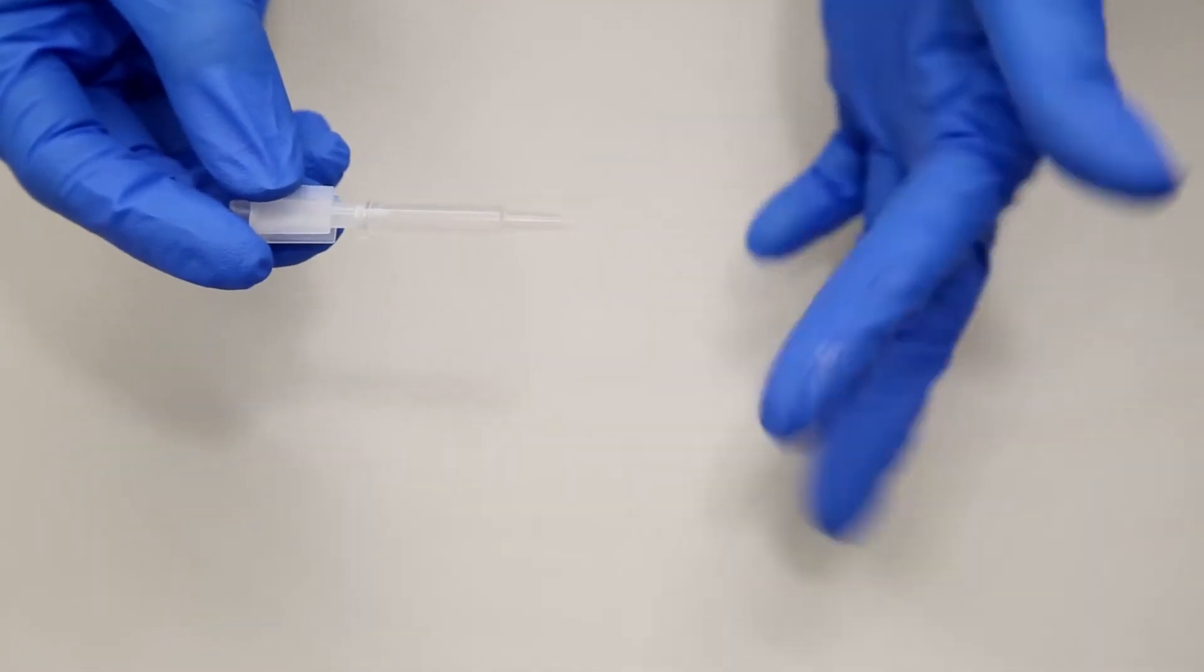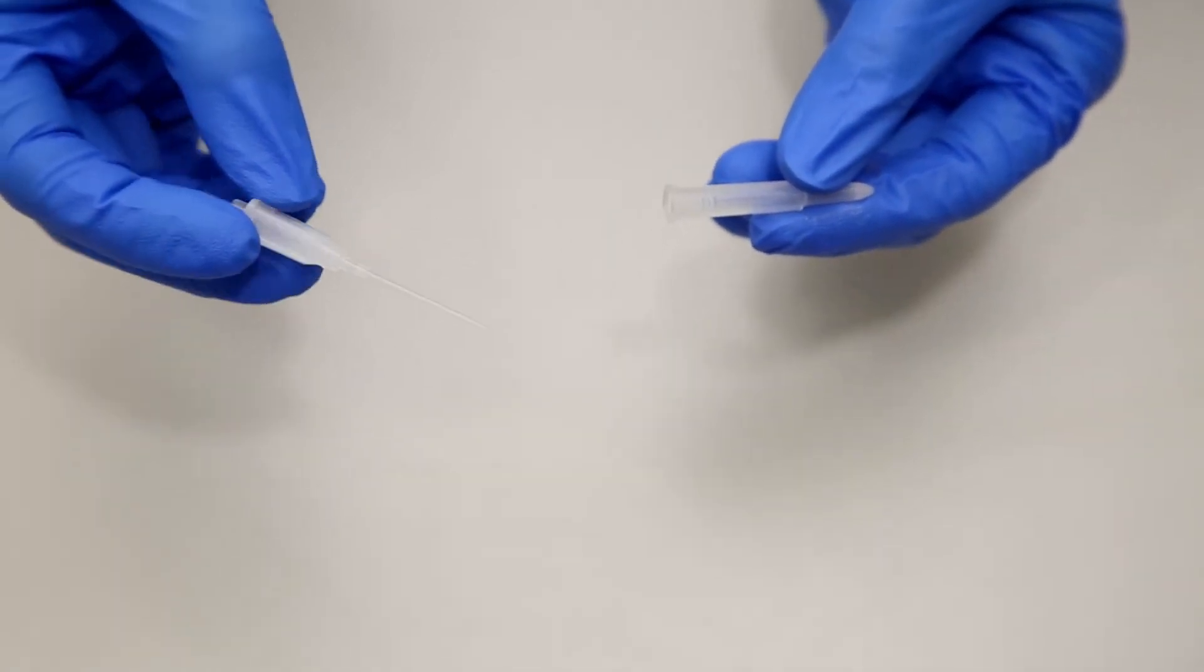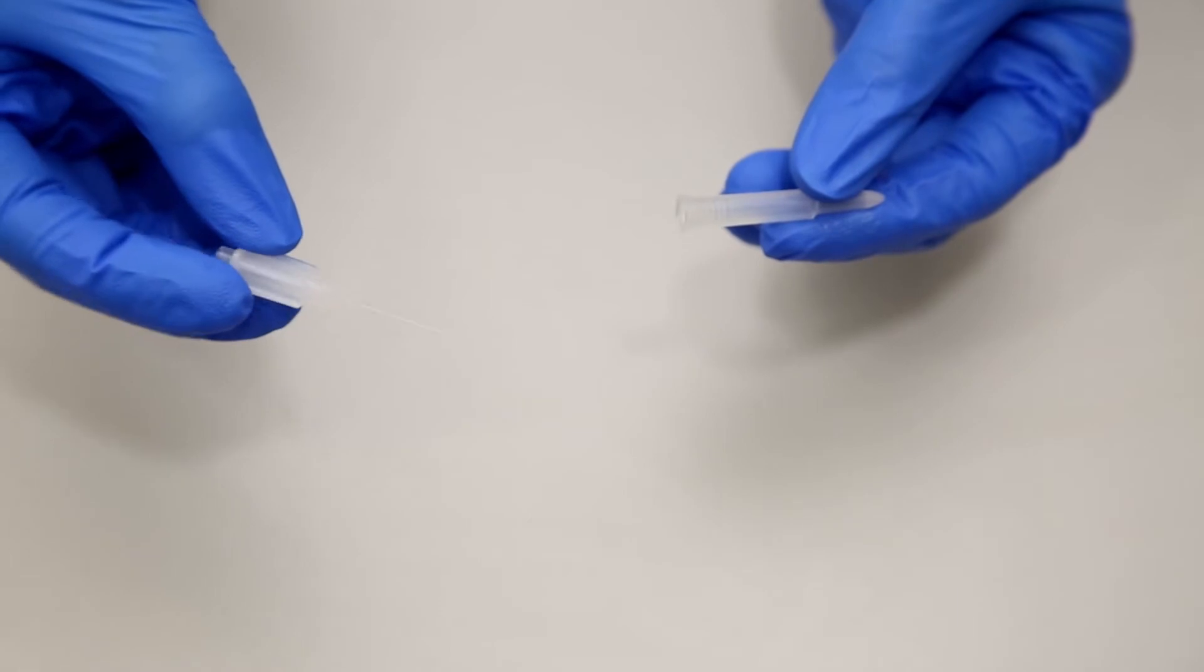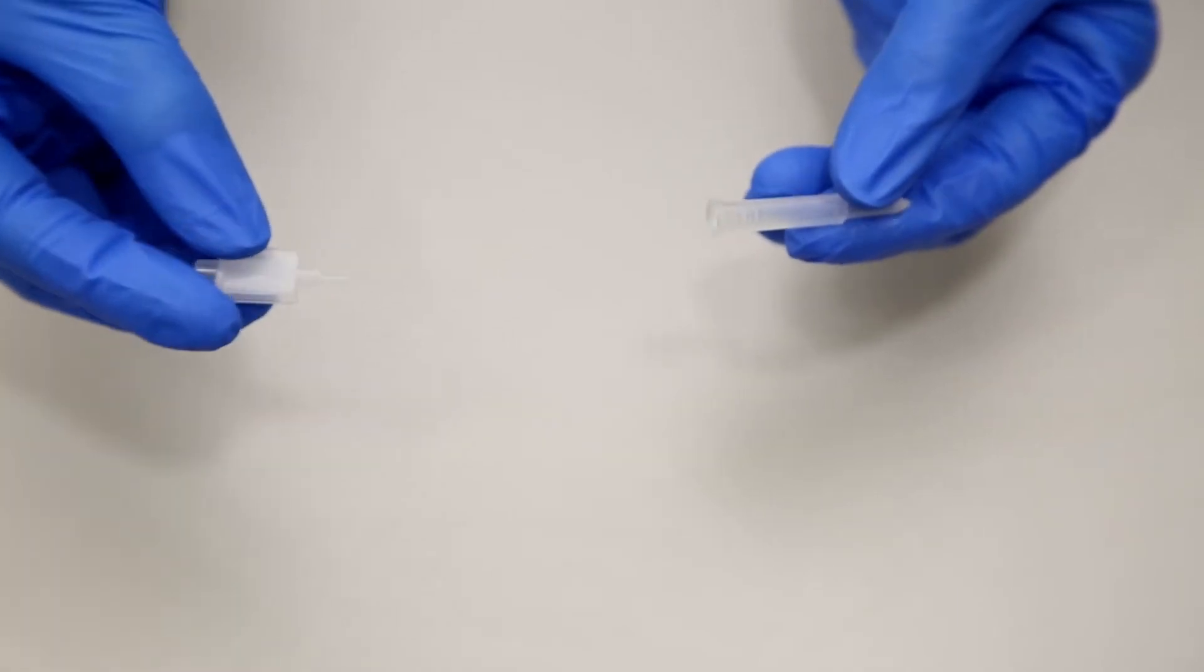The pipet is self-filling and contains 20 microliters of fluid. The pipet shield is used to puncture the reservoir diaphragm just before use and to protect the pipet.